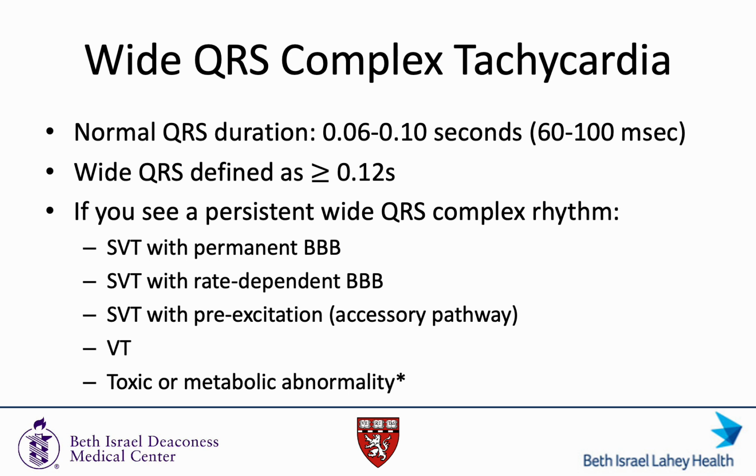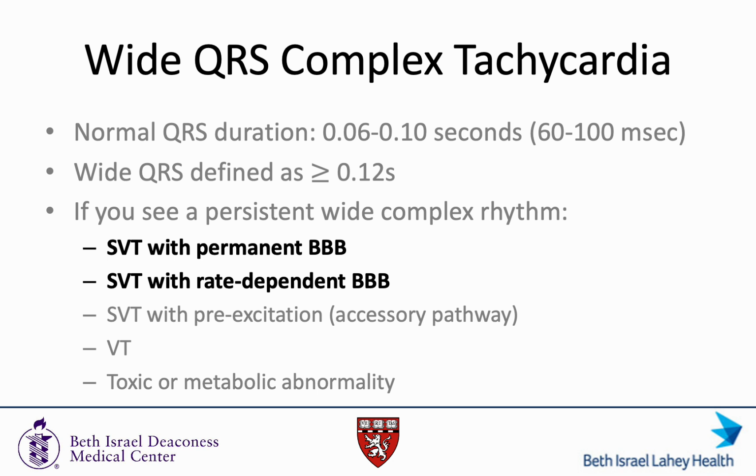I leave an asterisk here to note that the EKG changes in toxic or metabolic derangement, including but not limited to hyperkalemia, sodium channel blocker overdose, or digoxin or antimuscarinic toxicity, are numerous. These constitute a lecture on their own, really, so we won't spend that much time on these today. Let's start by distinguishing these two types of rhythms.